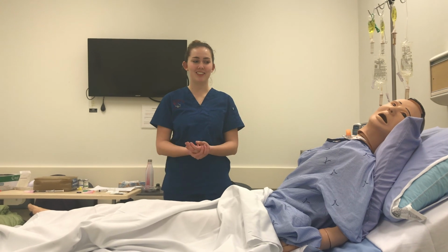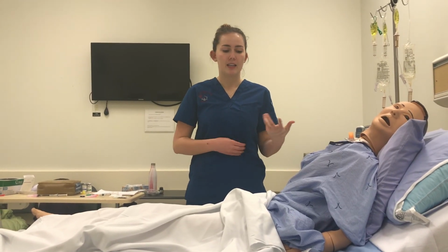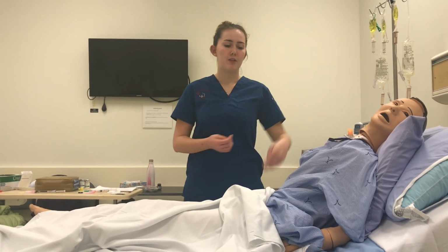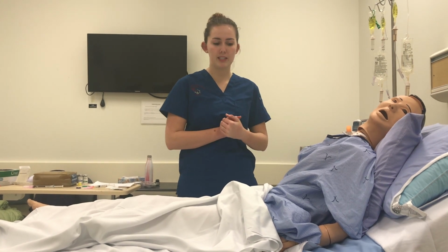Alright, so now what we're going to do is landmark for the location of our subcutaneous injection site. We can do this either in the abdomen, thigh, or lower back. For the purposes of this assessment, we're going to do it in the abdomen, 2 inches away from the umbilicus.